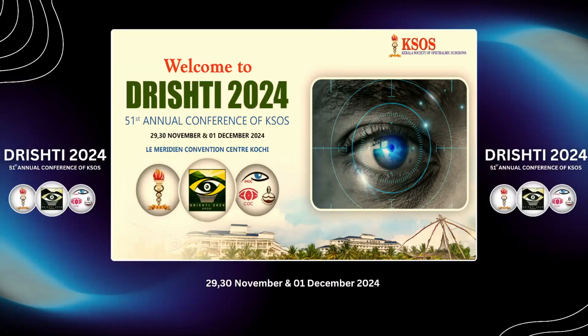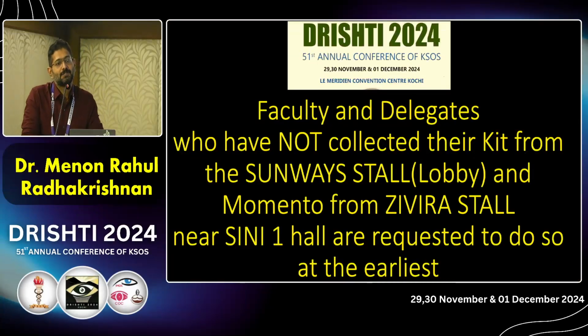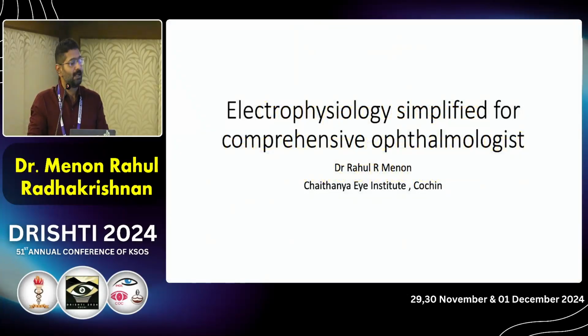As a VR surgeon, electrophysiology is something that we all kind of hate. The reason being, most of the big institutes have these electrophysiology equipments and we don't come across them in routine practice. So I've been given the tough task of simplifying it for a comprehensive ophthalmologist. I think it would have been apt if we had to simplify it for retinal surgeons as well.